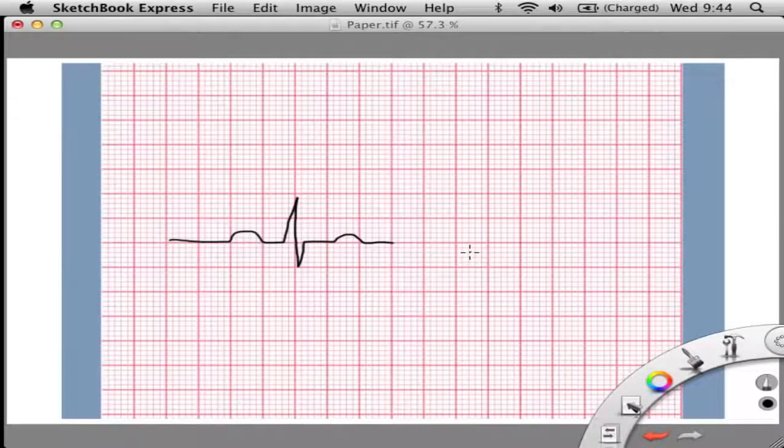You're going to look at it, and based off of the measurements and what's there, you're going to go, okay, it could be this, it could be this, it's not that, and you're going to weed stuff out of the list until you come up with one answer. You could not have P waves, you could not have Q waves, any number of things could happen. You could have inverted P waves, you could have inverted T waves. There's tons of things that can go on. Okay, did that answer your question? Gibbs, did I cover your question okay? Okay, anything else over just basic labeling of the rhythms?